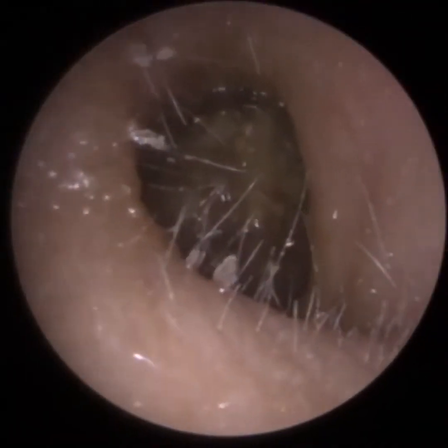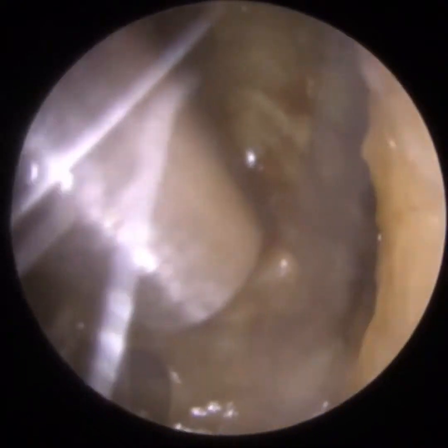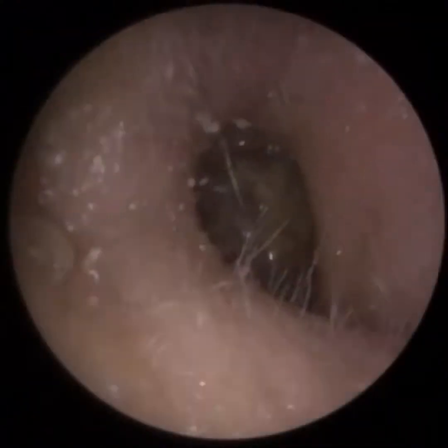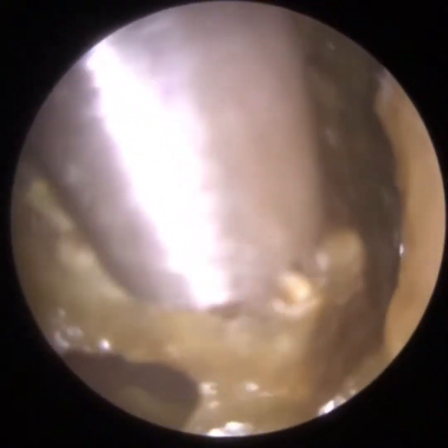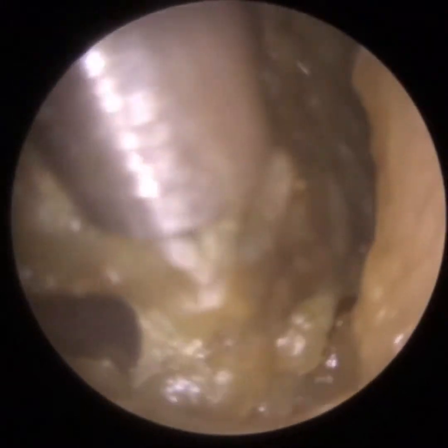It's of a patient who attended with bilateral fully occluding plugs of earwax. Now the patient was very anxious, quite sensitive, so it was a bit of a difficult case in that respect, because as soon as I entered the ear and the patient heard the suction noise and I made contact with the surface of the wax, the patient was fidgeting quite a lot.